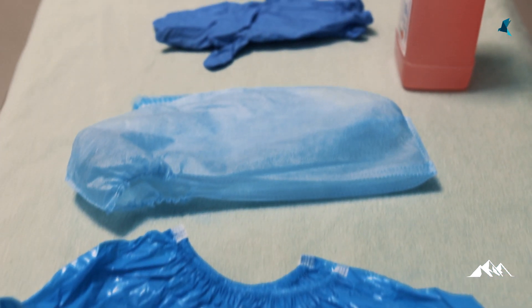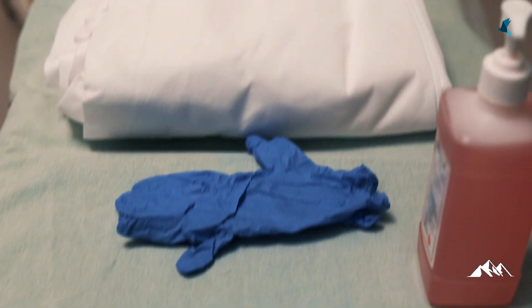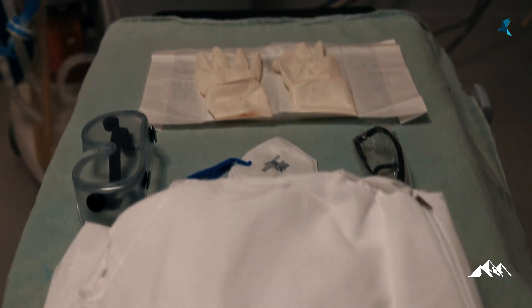Here are the components of the PPE kit: a pair of shoe covers, head caps, a pair of gloves, gown, goggles, and a respiratory mask.